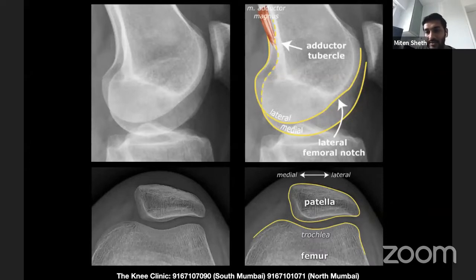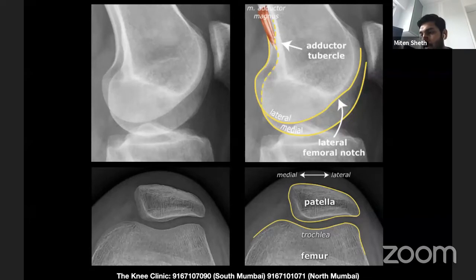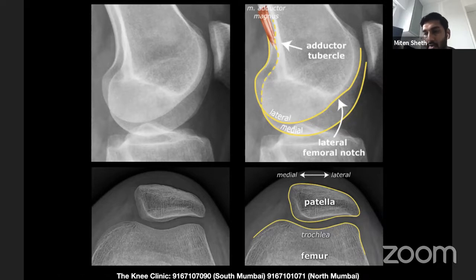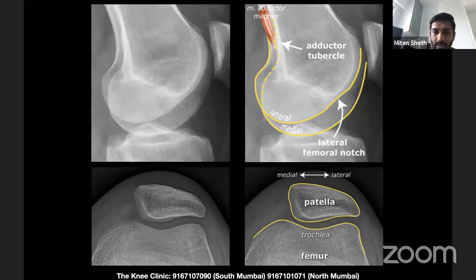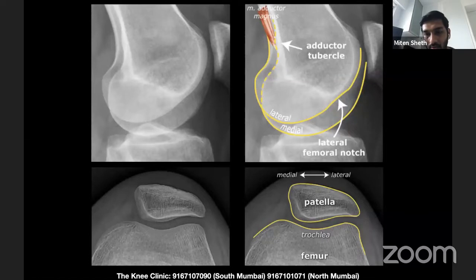Basic skyline views show the shape of the patella. There's a classification called the Wiberg classification — W-I-B-E-R-G — which identifies the lateral side and medial side and how the medial and lateral patella facets articulate with the trochlea.